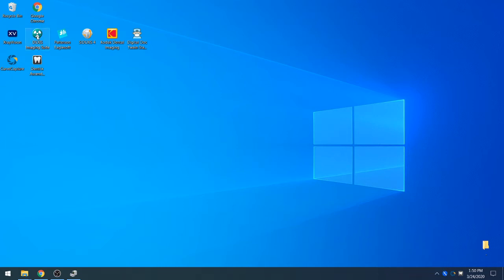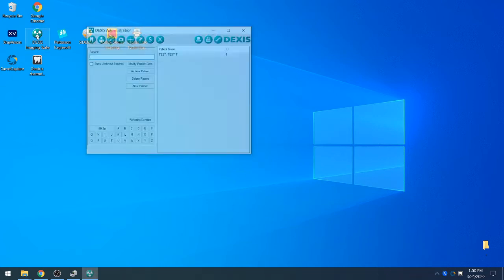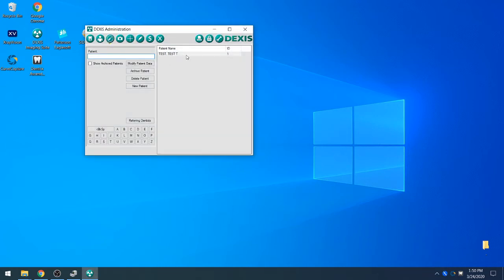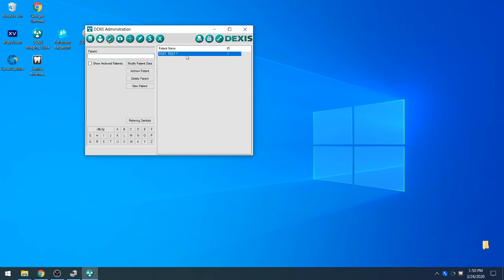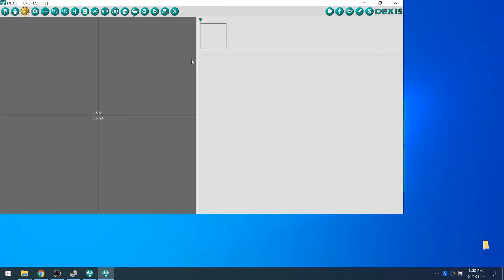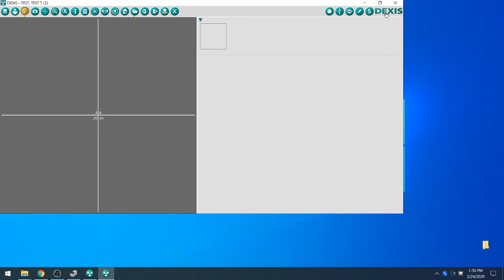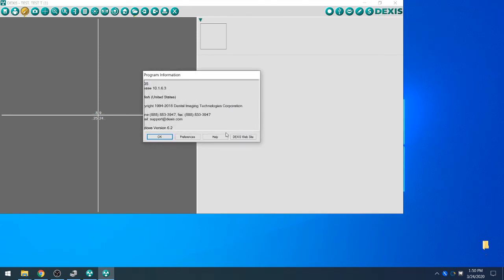We'll go ahead and launch DEXIS here and pull up our test patient. We'll go to the top right corner and select the DEXIS icon and go to Preferences.